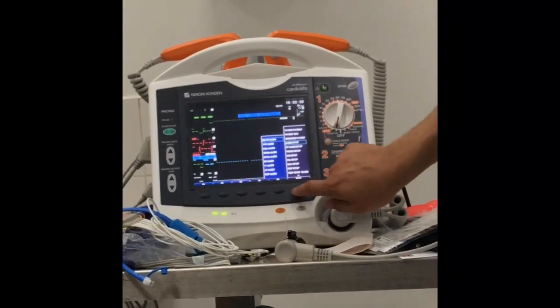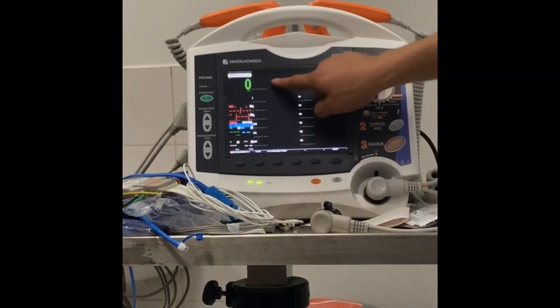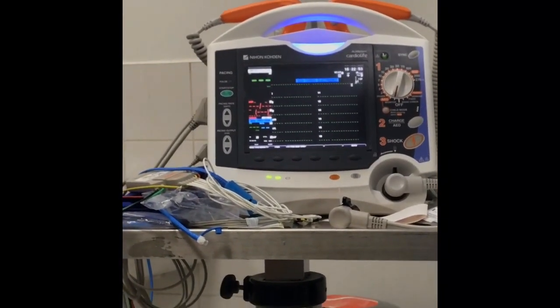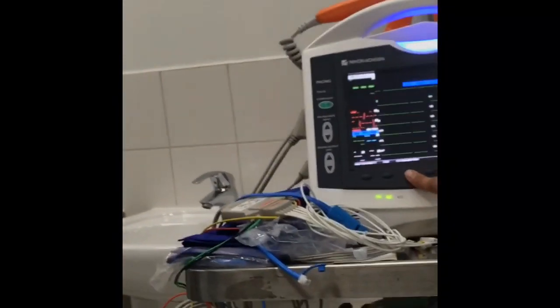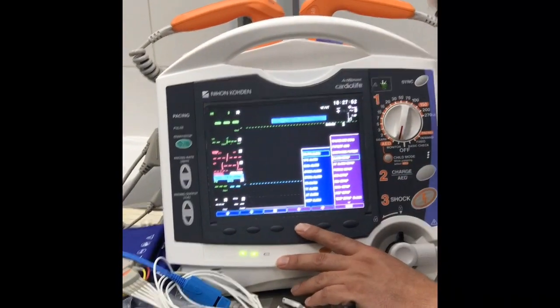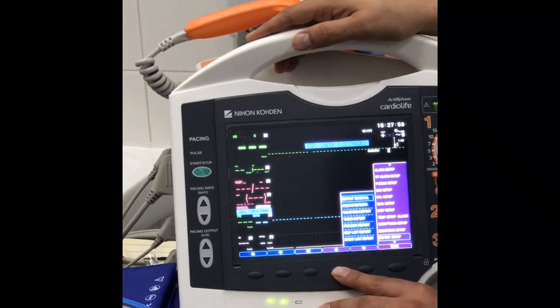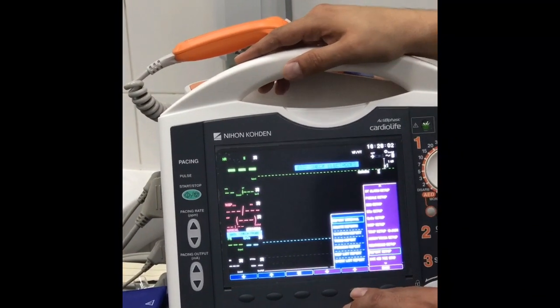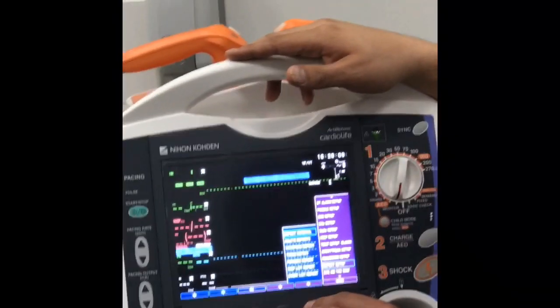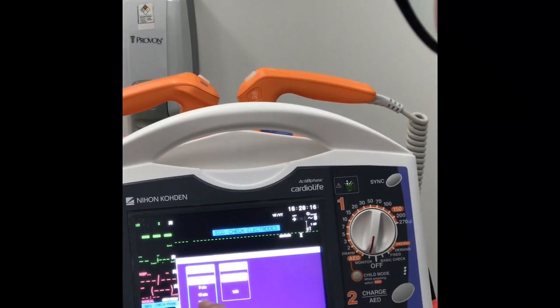So what is this color? Blue, with the blue arrow. Okay, go down. For example, you have to report it up. Let's say that this is the report interval. So it will be down. I want to put this one as a time interval. No, 10 minutes. We need the 10 minutes. The options are 1, 5, 15, 10 minutes. So we will go for 5 minutes.